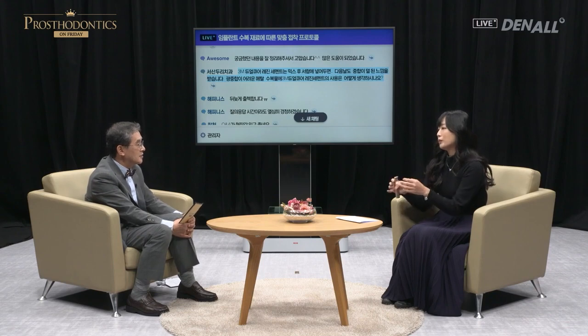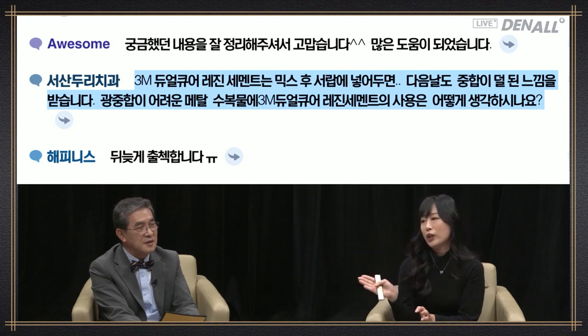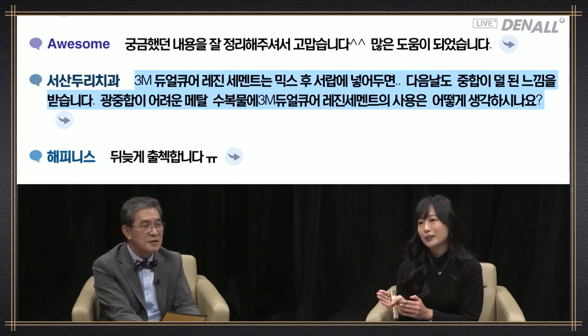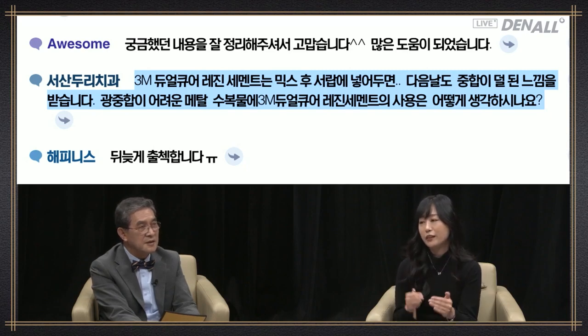In general, it is dual curing cement. However, light curing needs to be included. Light curing leads to better cementation strength, even if it is metal. You do tack cure on the marginal area and seal the marginal area and remove excess cement. And finally, you need to do as much as possible. In the case of metal restoration, you need to do light curing to increase cementation strength.